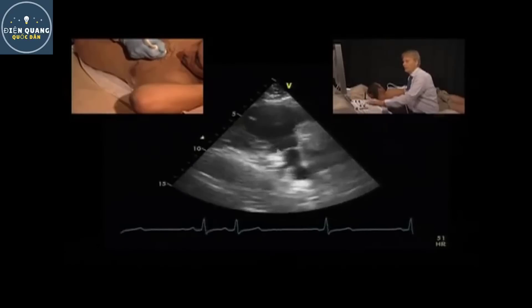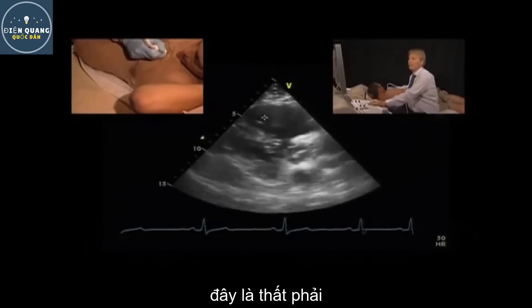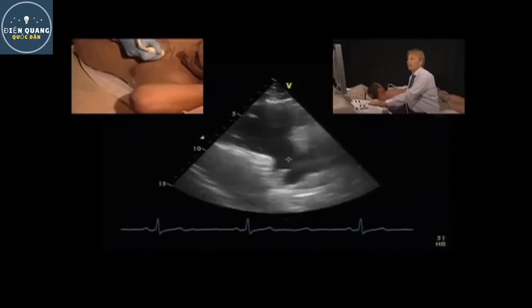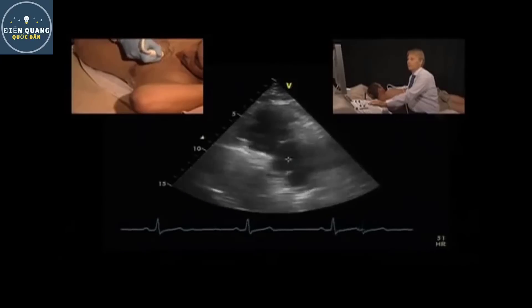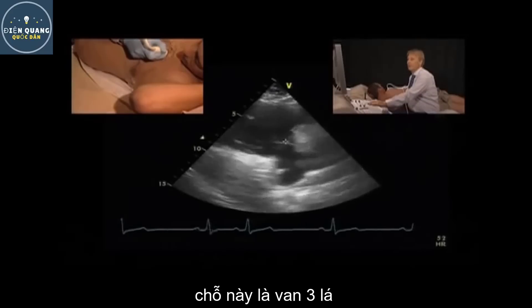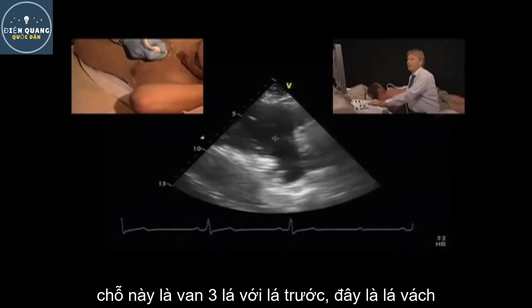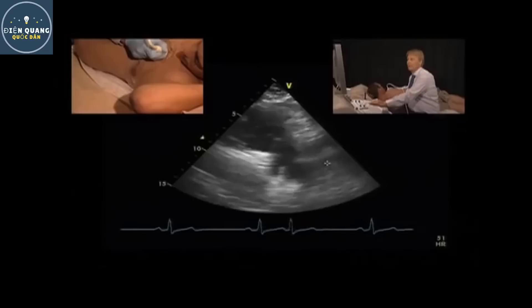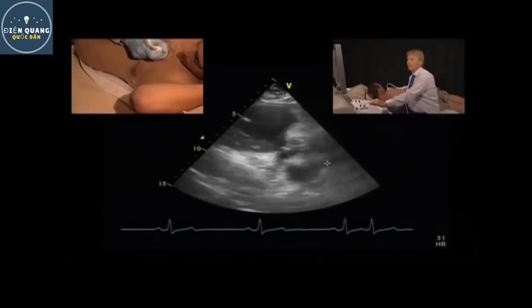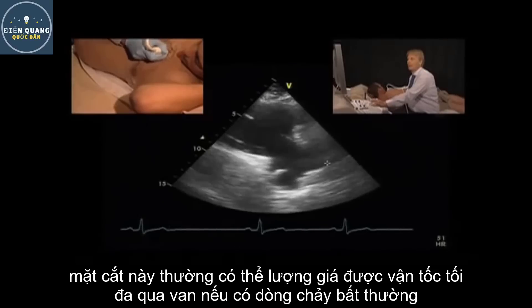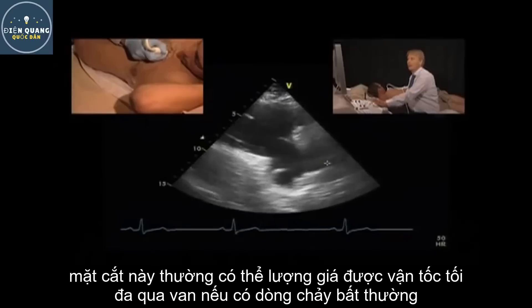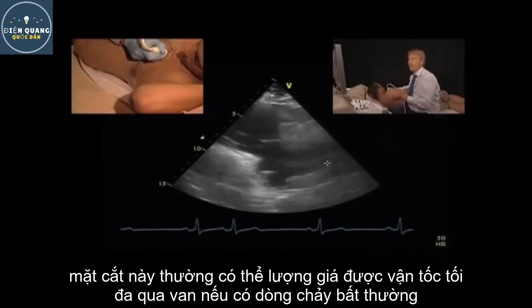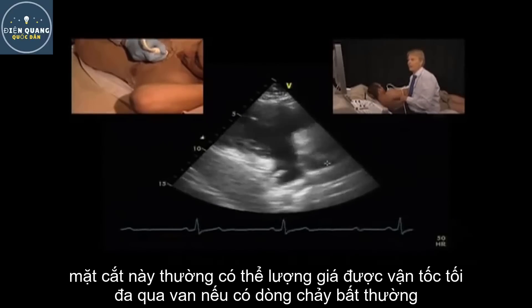This is the right ventricle here, this is the right atrium, and this is the tricuspid valve. This would be the anterior leaflet, and this is the septal leaflet. From this view it is often possible to even quantify the maximal TR velocity, especially if you have eccentric TR jets.